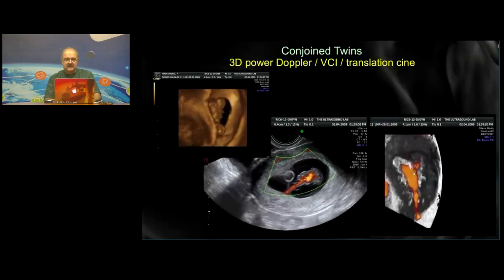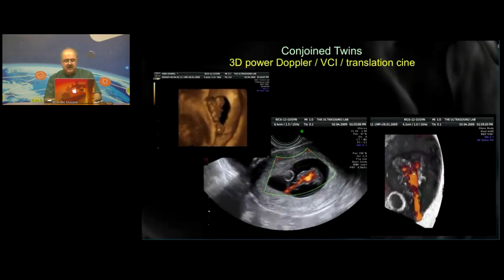And of course, this is cesarean delivery. So this is the stage where you can convince the patient that this is a lethal abnormality and would they like to carry on or not. And therefore, there's a lot of use that we will now highlight.